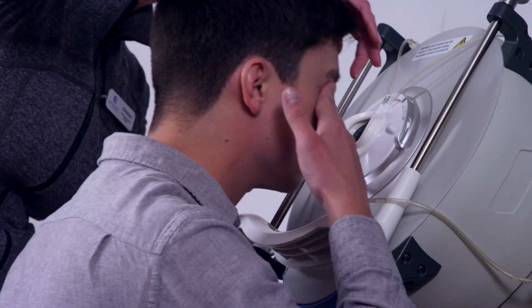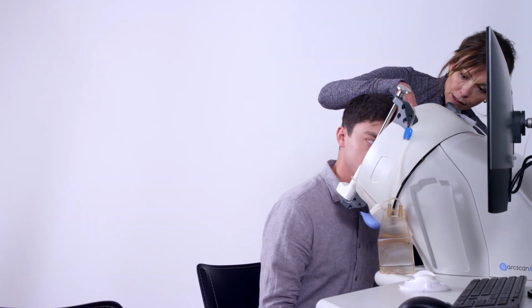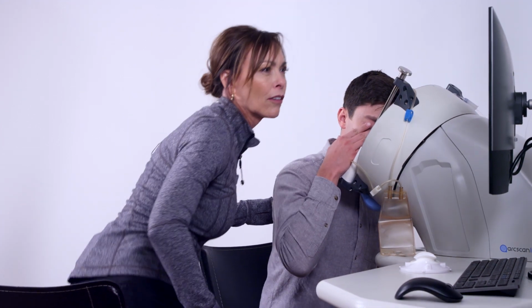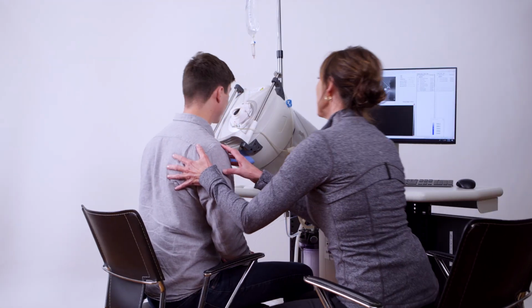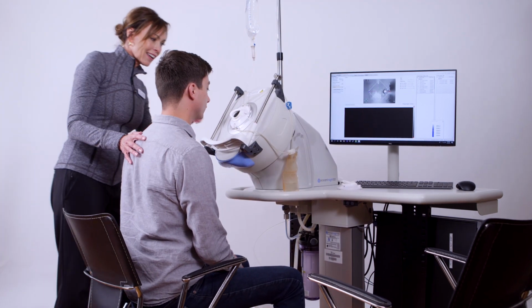A good starting point is to have the middle of the EyeSeal just about even with the bottom of the patient's nose. Some clinics will help the patient put an eye patch on the fellow eye, or you can instruct the patient to reach up with their hand and gently close that fellow eye after they've been positioned on the EyeSeal. Before introducing the saline, guide the patient toward the center of the EyeSeal as much as possible. They should lean in toward the fixation light within.